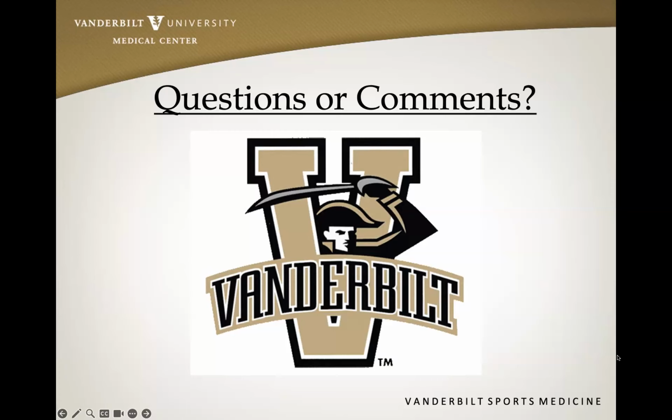I've found it helpful to minimize movement as much as possible, because sometimes you can introduce a little bit of error if you get off of the same points from your baseline to your stress measurement. But I was curious, when you're doing the radial ulnar deviation, are you having this done actively, or are you doing it yourself? Are you having an assistant do it?